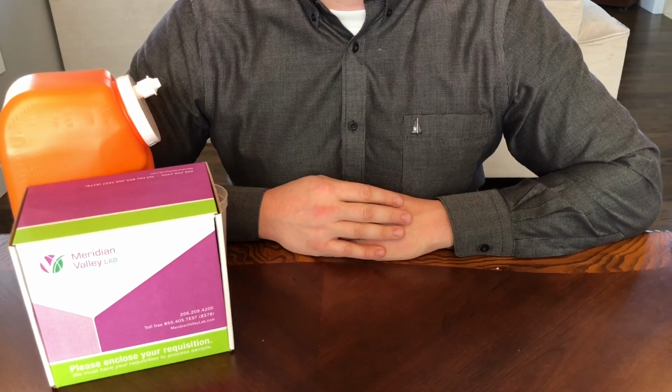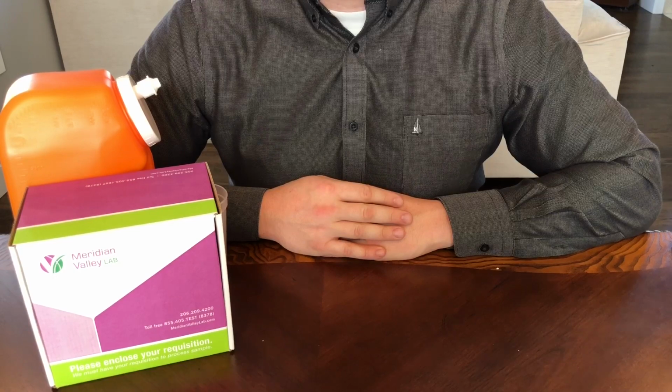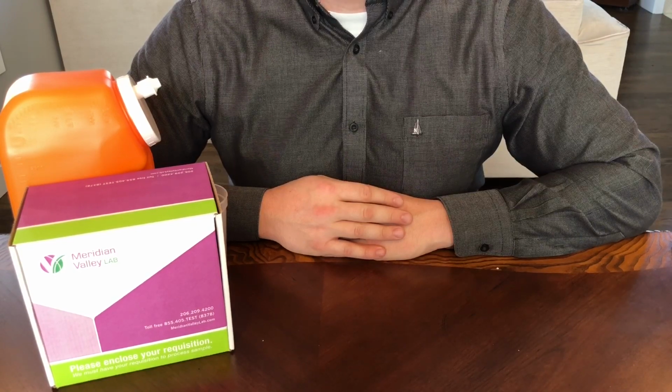On your written instructions provided in the kit, there is important information regarding hormone replacement therapy, hydration, which days to collect, and other factors that may apply to you. Please look over this carefully.